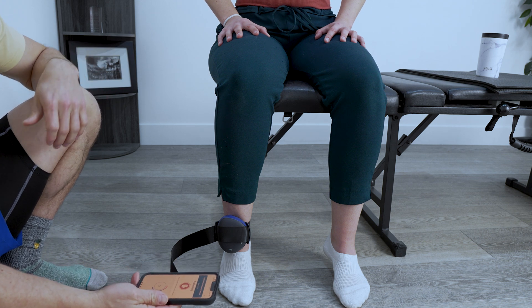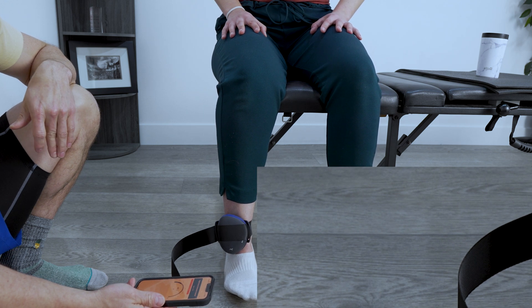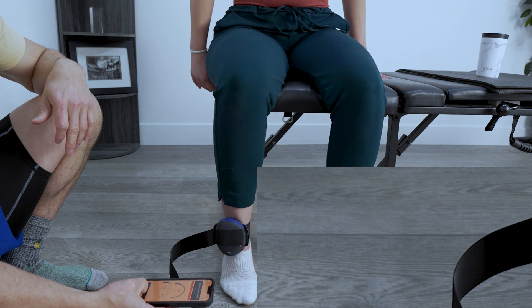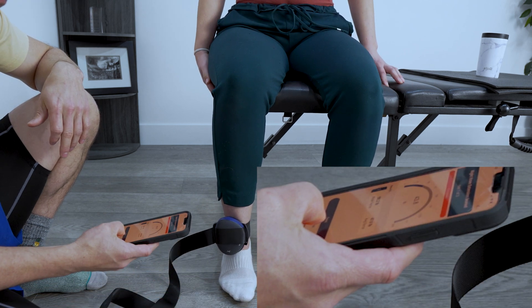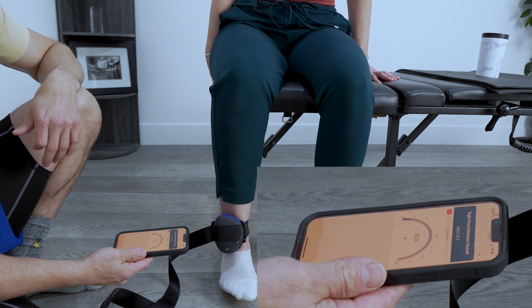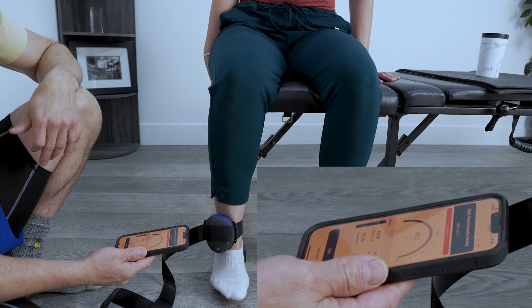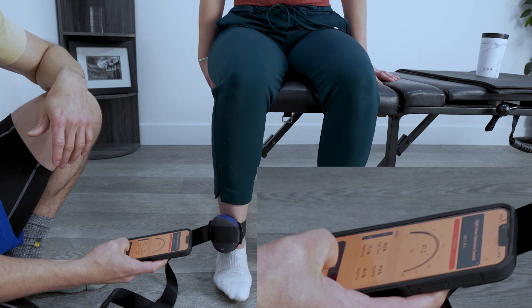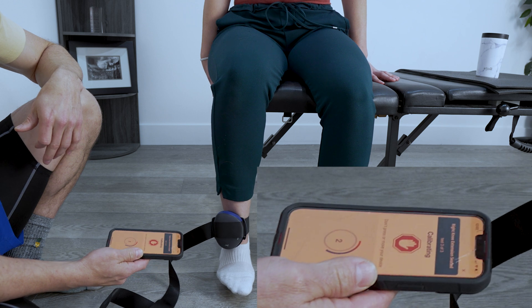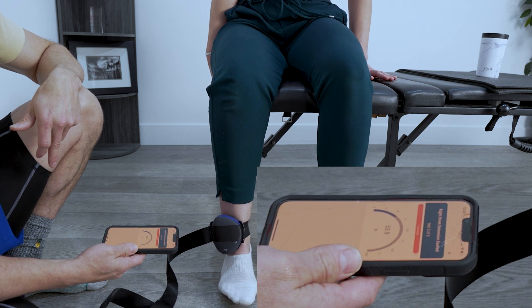Put it out. Two, one — push, push, push, push, push, push. Good. Feel okay? I think so. Here we go for three, two, one — push, push, push, push, push, push, push. Good. Go a little higher — three, two, one — push, push, push, push, push, push. Good.